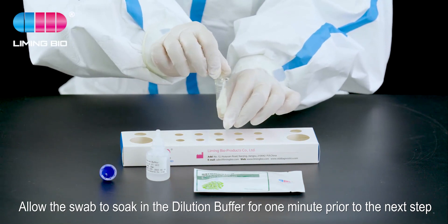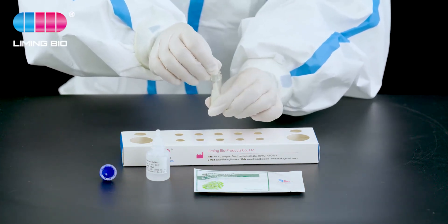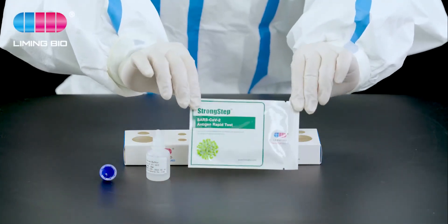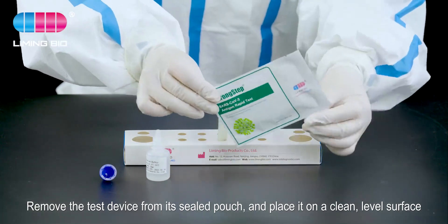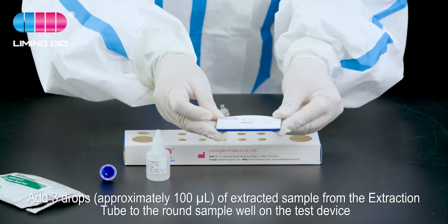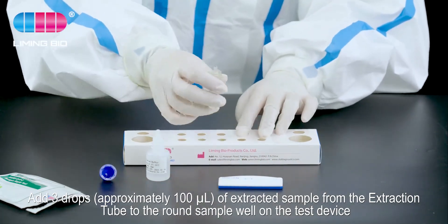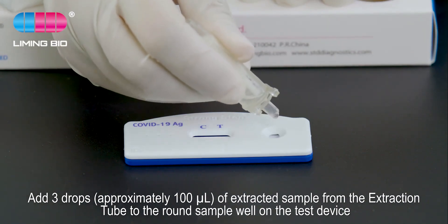Allow the swab to soak in the dilution buffer for one minute prior to the next step. Remove the test device from its sealed pouch and place it on a clean, level surface.